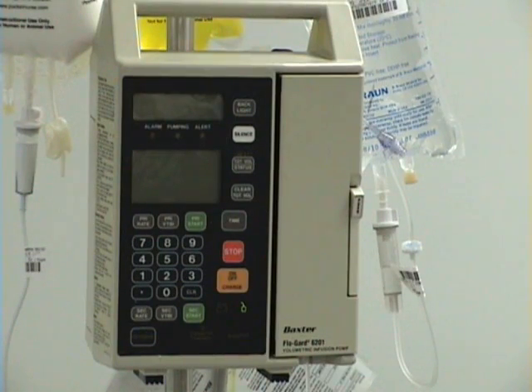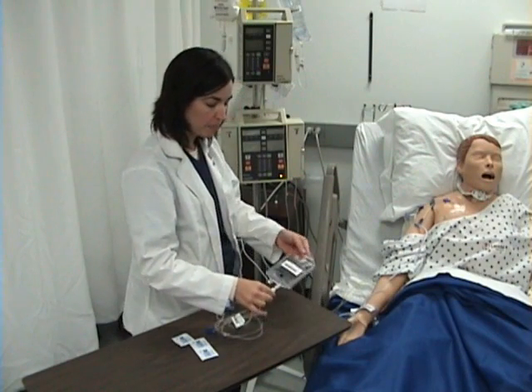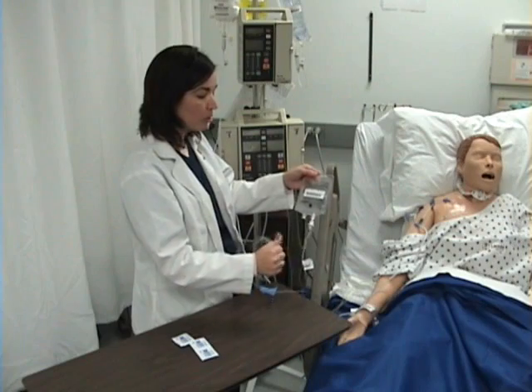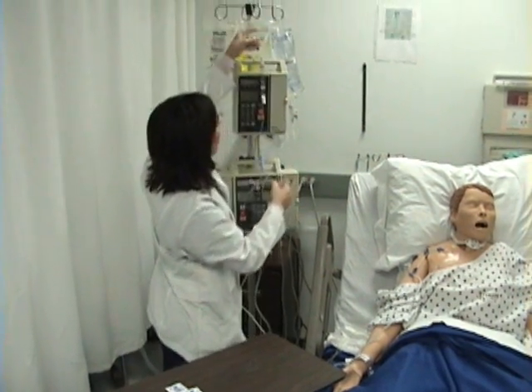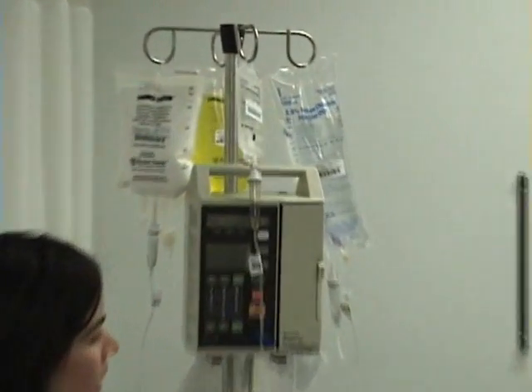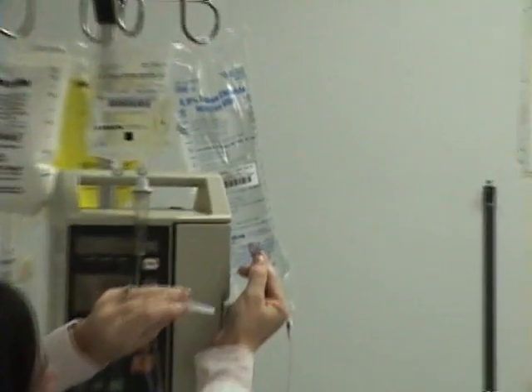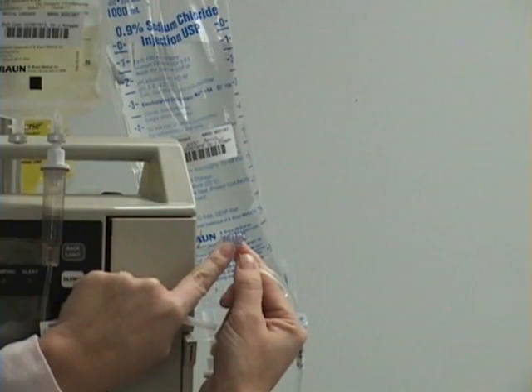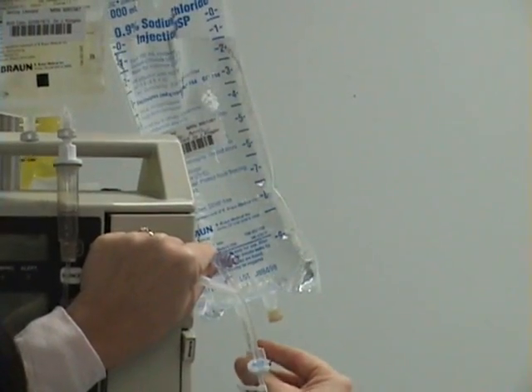After administering the IV Push Reglan, restart the normal saline. Now I will hang the IV Piggyback Nexium. I have already checked to see that this is compatible with the normal saline IV fluids that are running. I will hang the piggyback on the hook and attach the end of the piggyback tubing to the port above the IV pump, or the port that is closest to the bag of IV fluids.